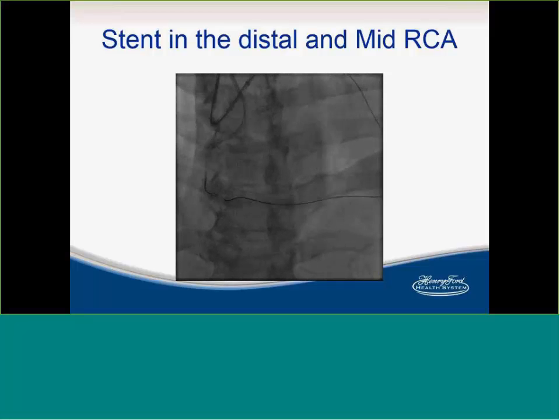And actually, quite often, at least we use a lot of Fine Cross for the epicardial specifically, and that's harder to twist anyway. But they have pretty good tracking, and they're very soft. So it goes with gentle pushing and patience. Absolutely. I use a Fine Cross if I fail.